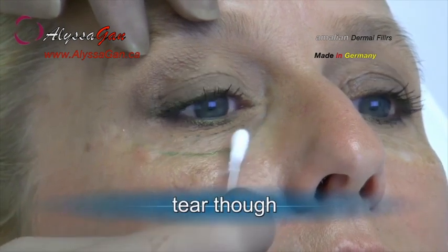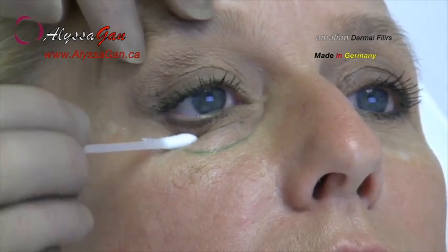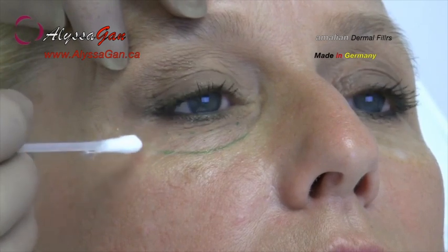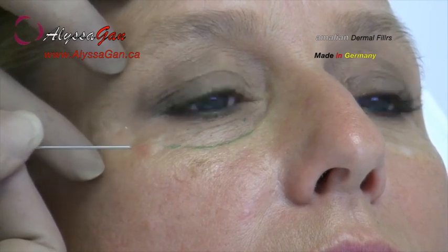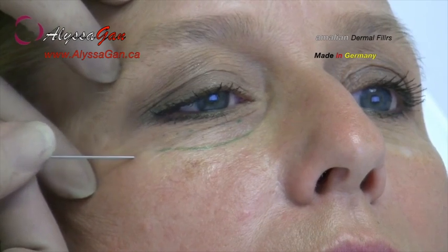Now we show a lower lid augmentation. Above the orbital rim, the maximal border for placement of the implant relative to the eyelid is marked. Laterally, we can see a bulge that was caused by anesthesia with lidocaine. Preparation of the hole for injection is again made using a short cannula.